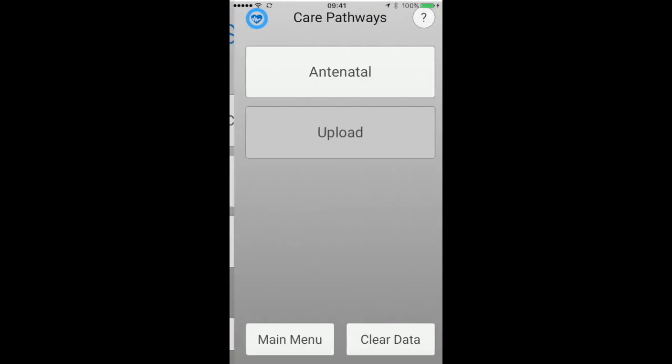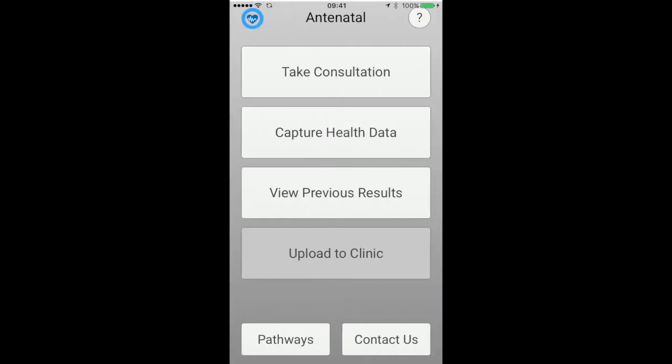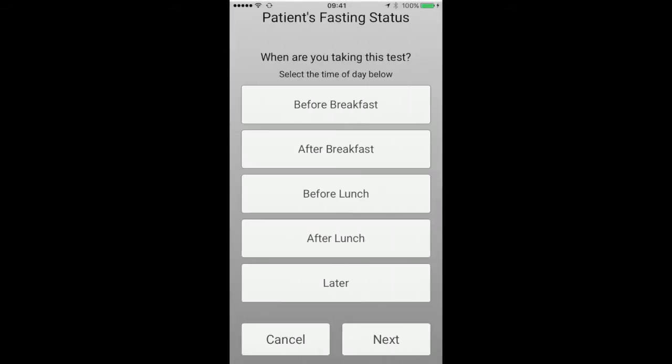On the SmartMed app, select Care Pathways, then Antenatal. Now select Capture Health Data. Select the blood glucose test and then select the AgaMatrix WaveSense Jazz. Finally, select the time of day you're taking the test.